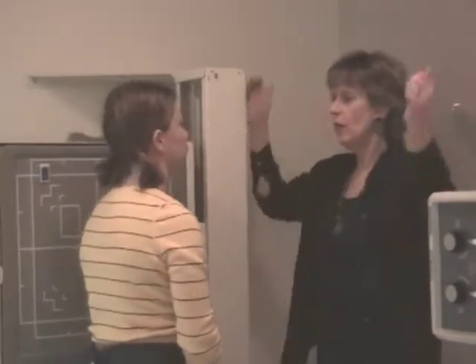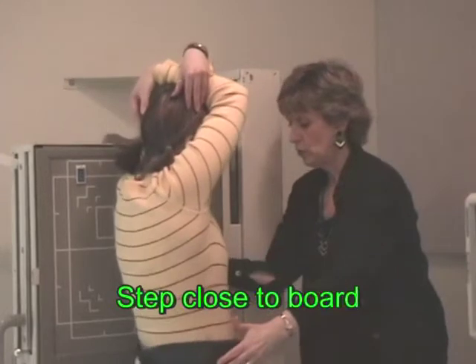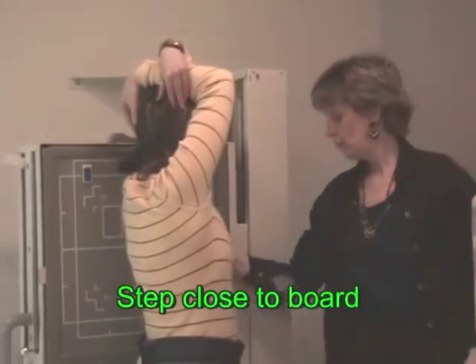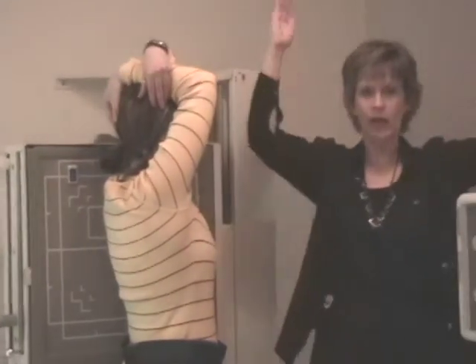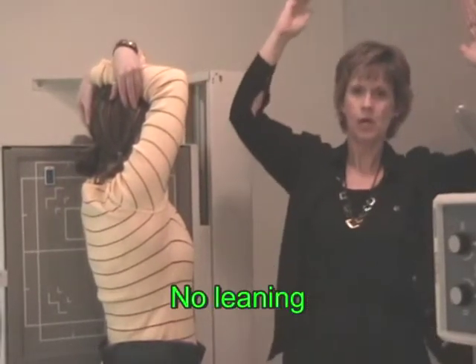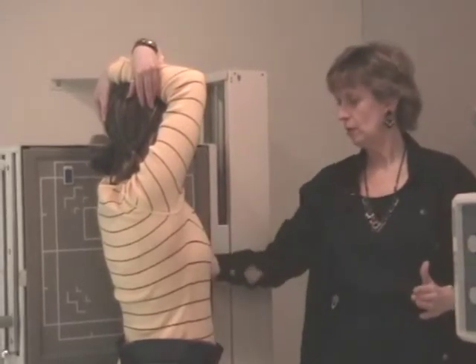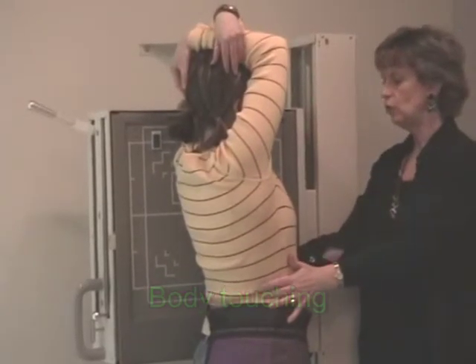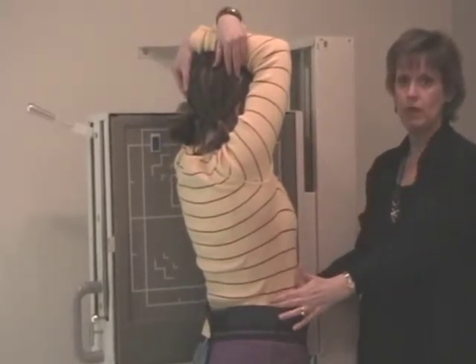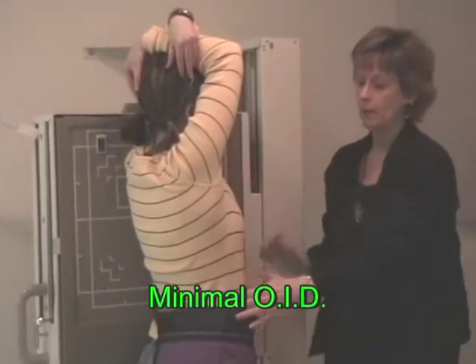Okay. Can we bring your arms up over your head, please? That's good. Have your patient step close to the board. Okay. Now I'm looking at her. Sometimes the hips can be wider. You don't want leaning. You don't want this scenario in any way. You want the patient very straight. But you do want the body touching. If I can only get the hips touching or the shoulders touching to keep the body straight, then I'll live with that. Keep the body straight with minimal OID. Okay.